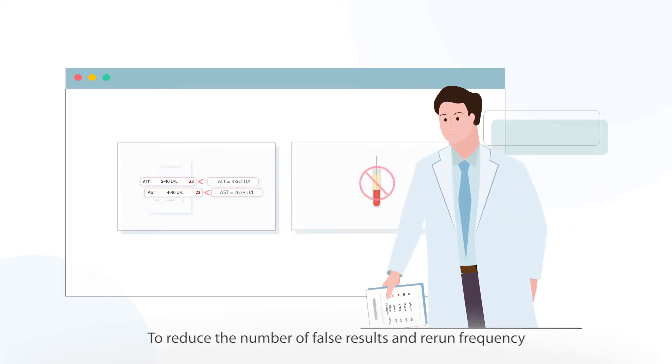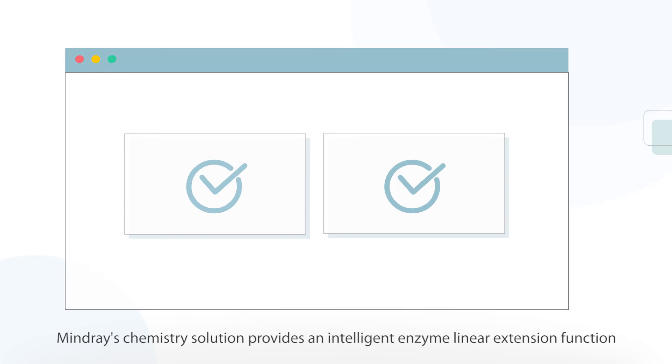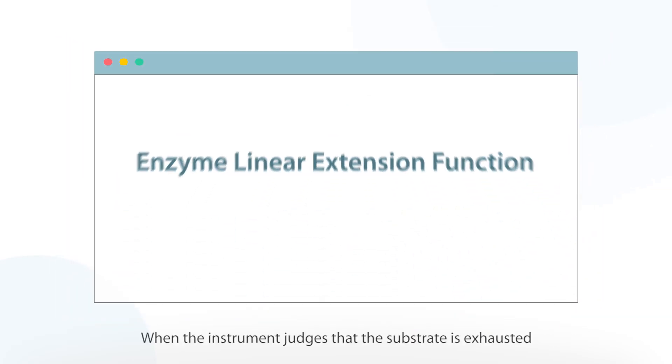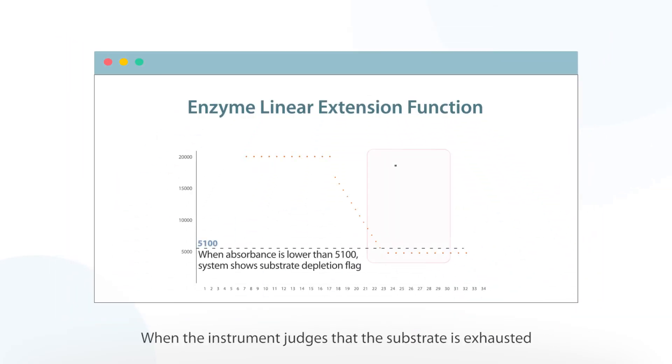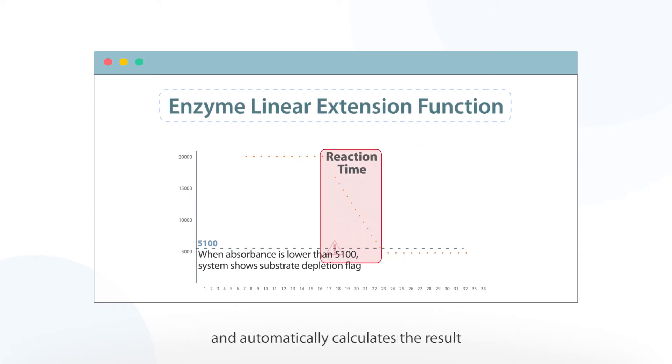To reduce the number of false results and rerun frequency, MindRay's chemistry solution provides an intelligent enzyme linear extension function. When the instrument judges that the substrate is exhausted, it starts the enzyme linear extension function and automatically calculates the result using the absorbance point in the linear change.